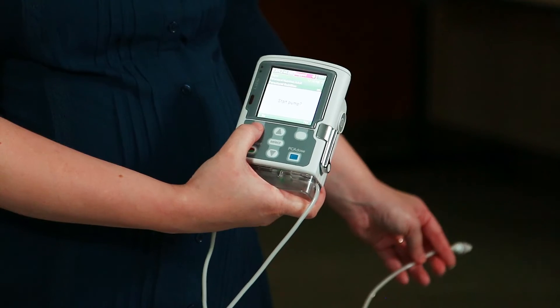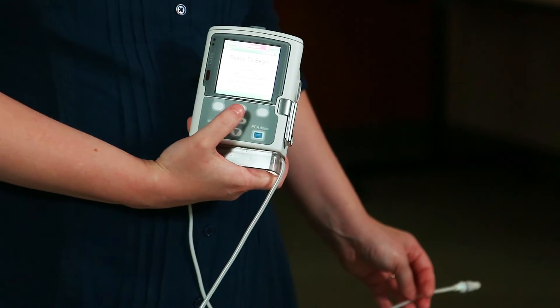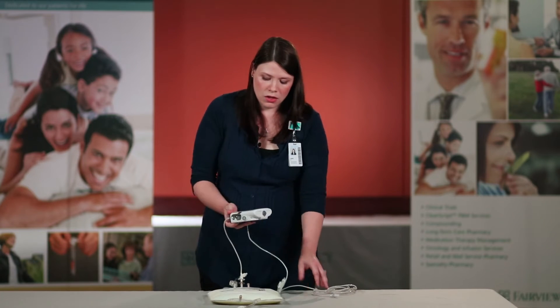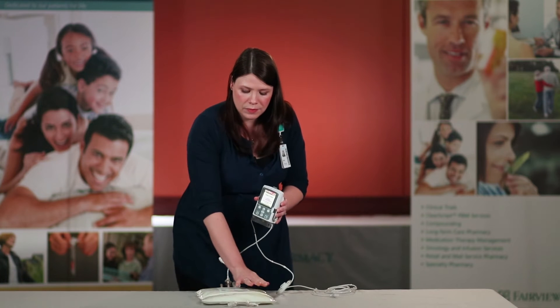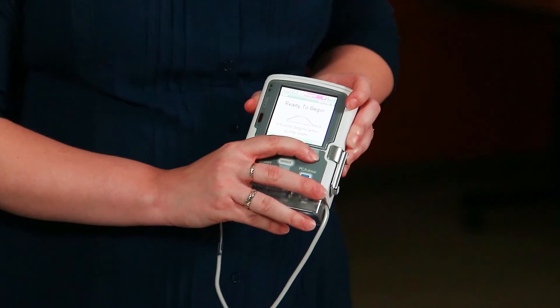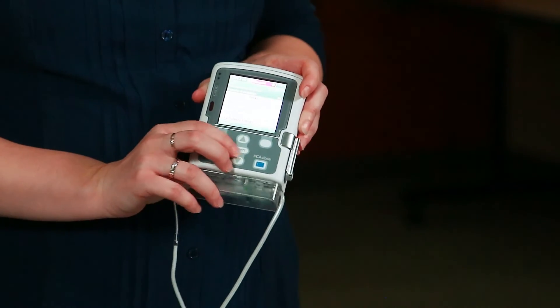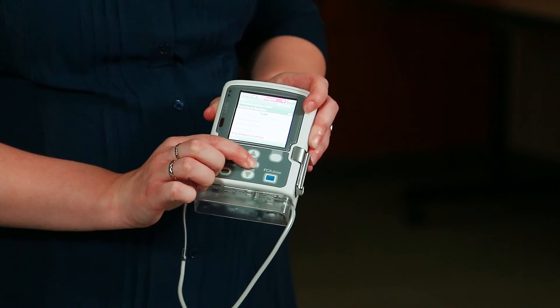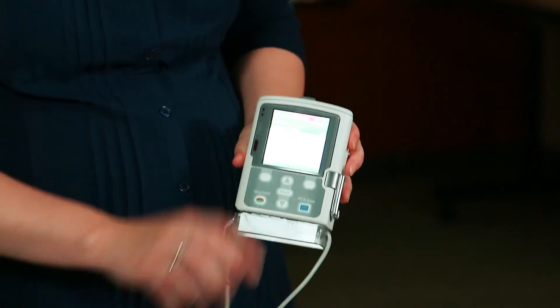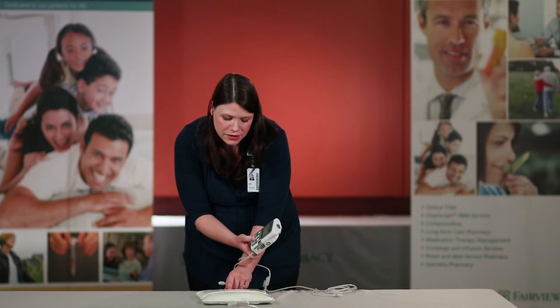It will then display 'do you want to start the pump?' Once again you are going to push 'no.' This is because we want you to always double check your settings on your pump with the label of your TPN bag. To do this, go to your task — press the soft key under 'task' — scroll down until you highlight 'view delivery settings,' and push select in the middle of your keypad. You now want to verify that all of the settings on your pump match your TPN bag. Scroll through the settings, verifying that these are correct.